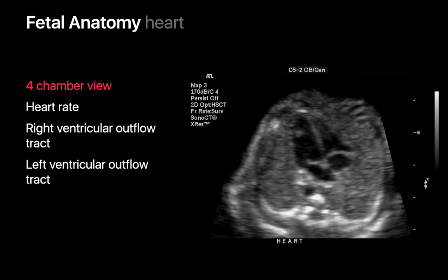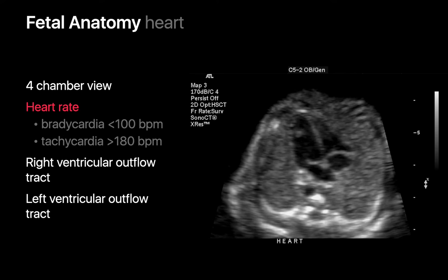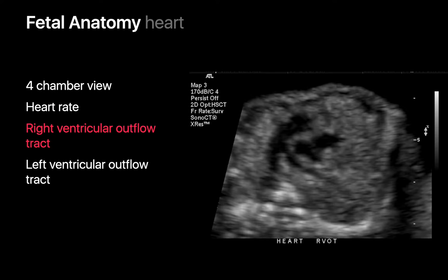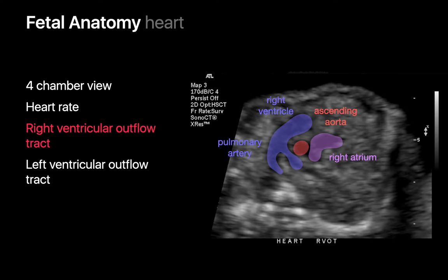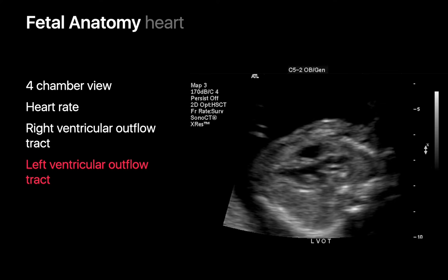Our assessment of the fetal heart begins with evaluating its morphology and function on a four-chamber view. We measure the fetal heart rate, noting if the rate is either below 100 or above 180 beats per minute. We then assess the right ventricular outflow tract and the left ventricular outflow tract.